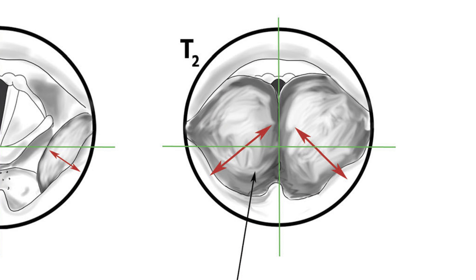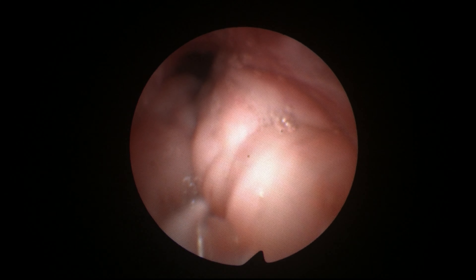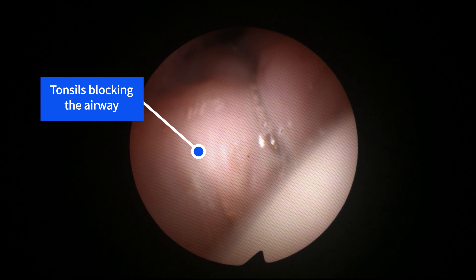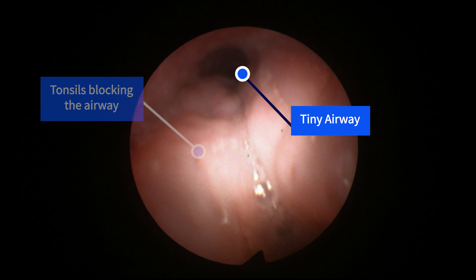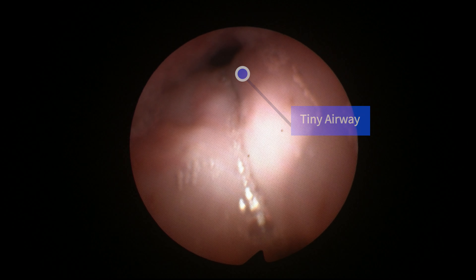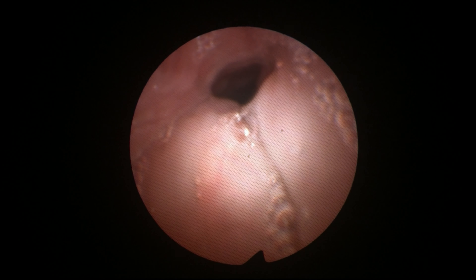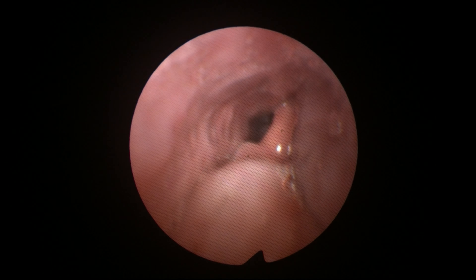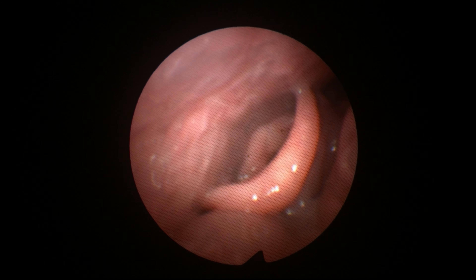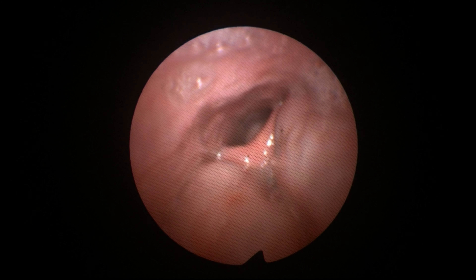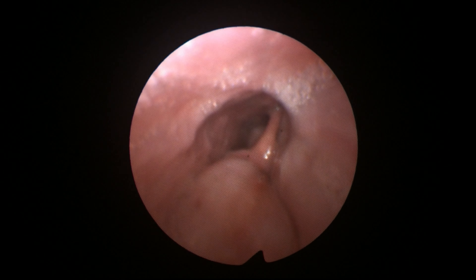Now we move on to T2 tonsils, where the tonsils are so large they take up more than 50% of the airway. These massive tonsils are completely obstructing the airway — the patient only has a tiny airway right at the top from which to breathe. This gentleman had obstructive sleep apnea and had been using CPAP for over eight years. After a ten-minute tonsillectomy operation he was completely cured and very happy.